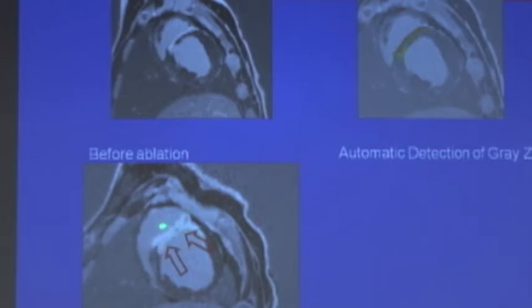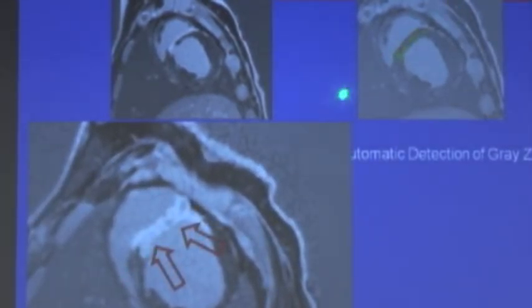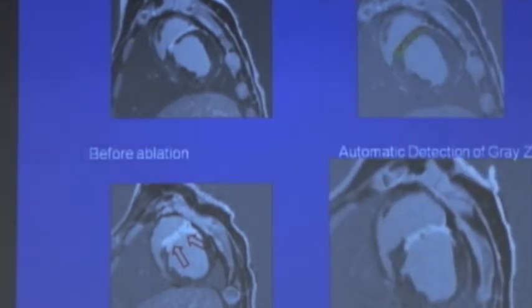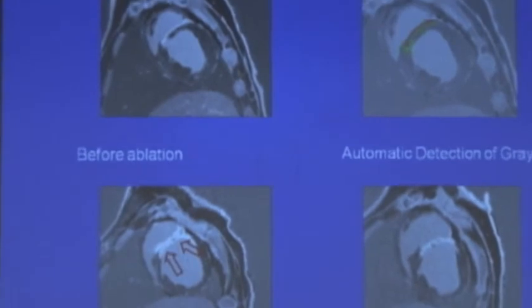Actually, another potential advantage of MRI is you can do thermography with that, but I really won't get into that. So anyway, if you look at this image compared to this image, you see that whole area of heterogeneity was destroyed. And again, this was using standard electrophysiologic criteria. And then a week later, it pretty much looked the same. Some of the edema had resolved, but again, the whole gray zone is gone. This was just a crater right there. And this animal was non-inducible chronically.